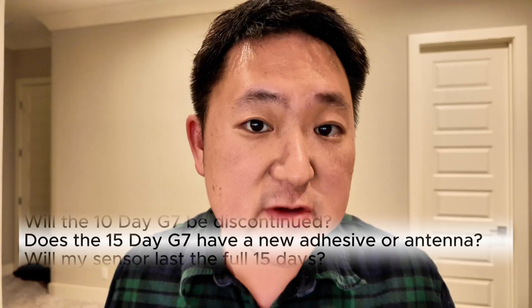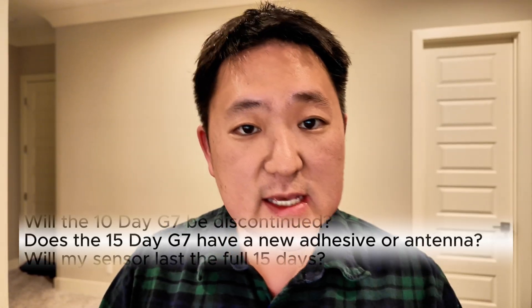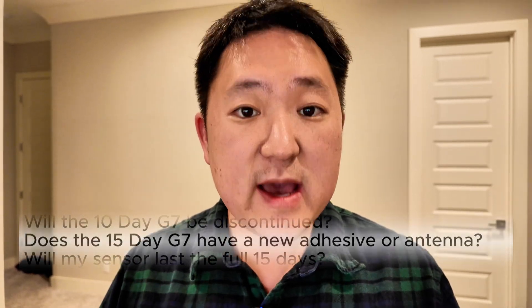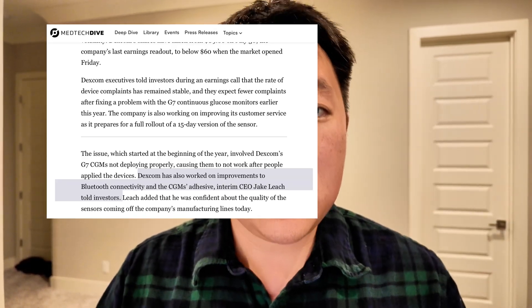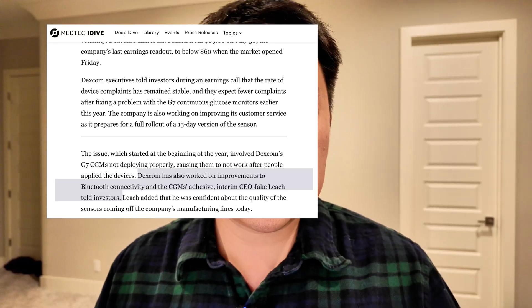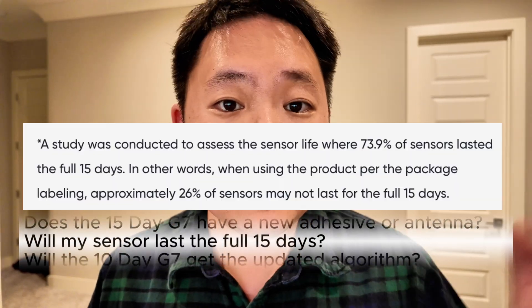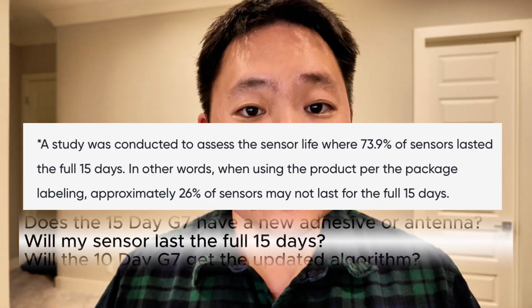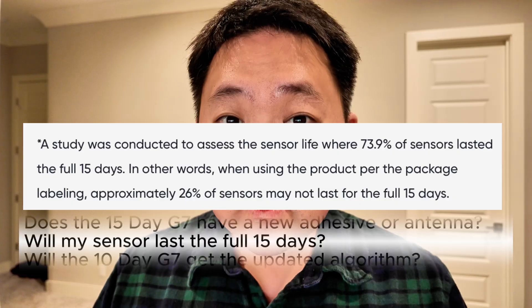As far as we know, there has been no official statement saying that the 15-day has a better adhesive or new antenna. However, over time Dexcom has been improving the adhesive and signal strength of the Dexcom G7 ecosystem. As many people have pointed out, there is an asterisk in their marketing material stating that only 74% of sensors lasted the full 15 days, so not every person is going to be able to make each sensor last the full 15 days. That said, Dexcom has been pretty transparent about replacing sensors and really trying to make sure that patients have the best experience.